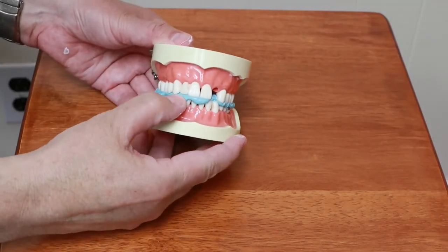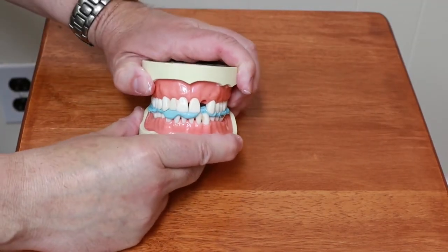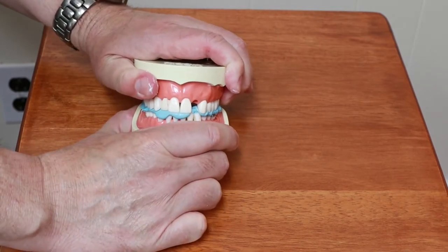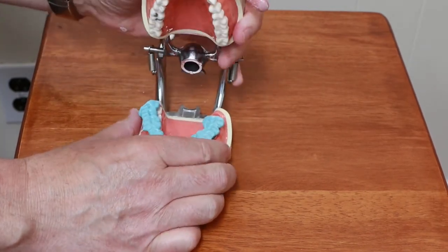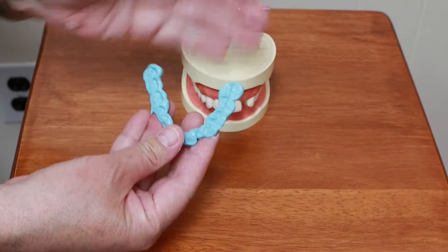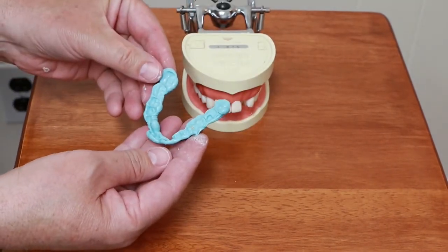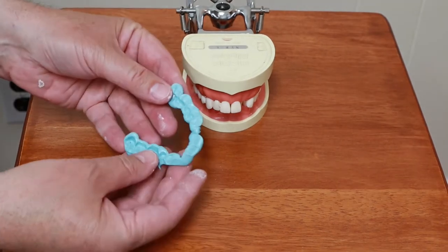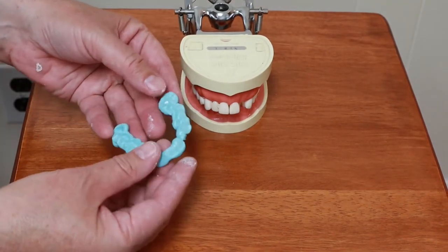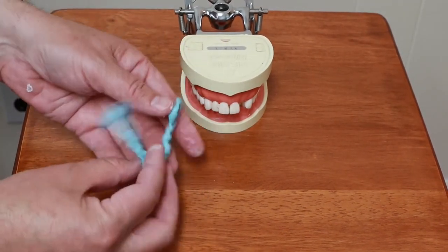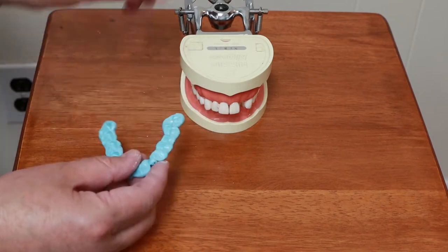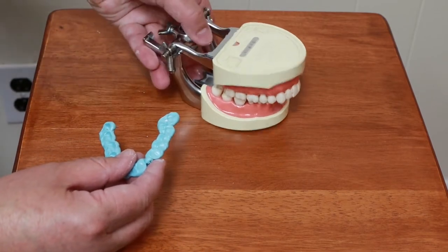So it's been a minute, the blue mousse is set up. Let's have Buster open. There we go. Now we have the bite registration that shows the lab how the teeth will fit together. So when they have both models for the upper arch and lower arch, they can put them together correctly and mount them on a hinge similar to what's here.